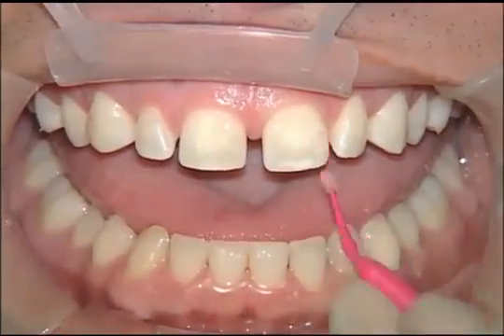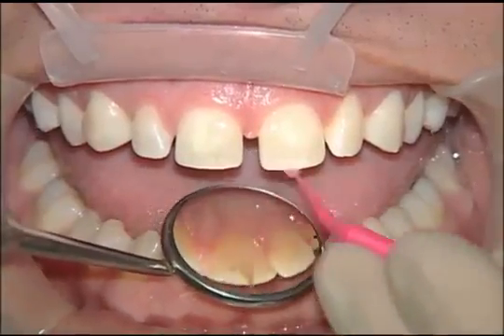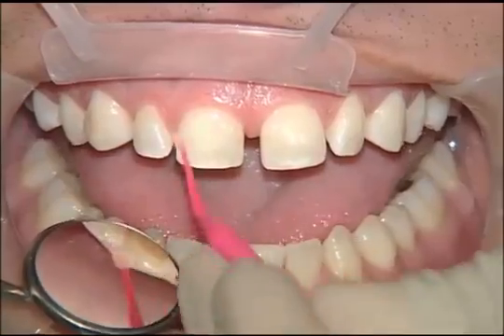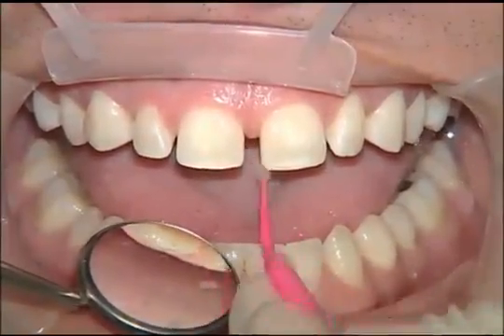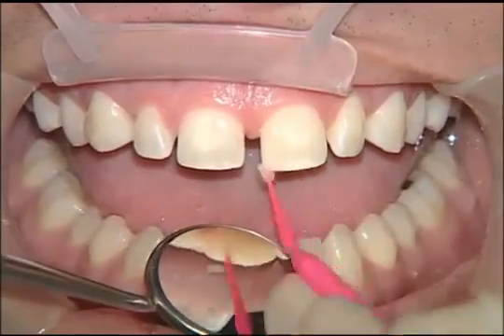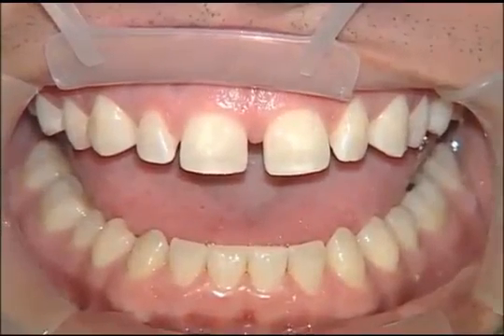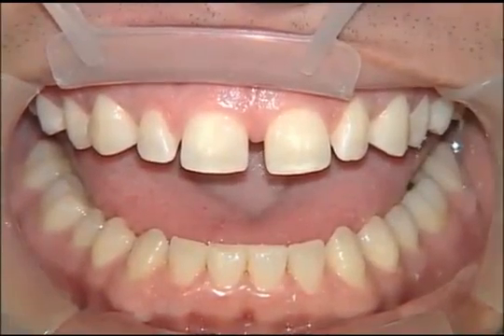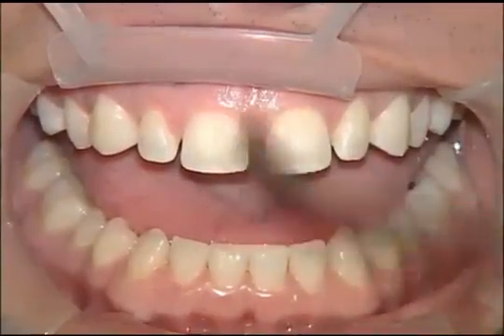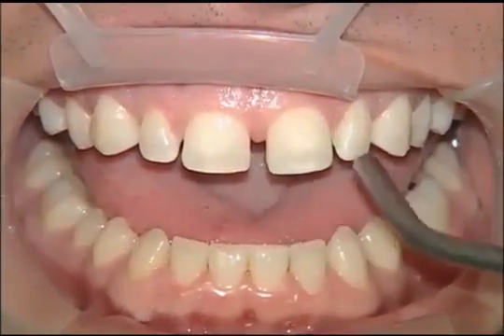So we're going to go ahead and coat the entire etched enamel surface with the adhesive from the Scotch Bond Multi-Purpose Plus system, as well as making sure we get the lingual third as well, because the veneer is going to wrap over the incisal edge. As we're doing this, my assistant has cleaned the veneers, removed the water-soluble try-in paste from the veneers, and has placed the silane for 60 seconds, evaporated, and then placed a layer of the Scotch Bond inside the veneers and air thinned those as well. I'm air thinning the adhesive on the teeth right now to make sure that we don't have any pooling anywhere down by the gingival margin or anywhere else on the tooth.